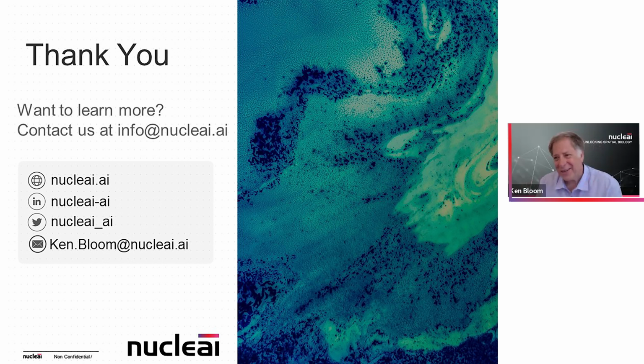It can classify every cell and understand the relationships between every one of those cells. So I could do it painstakingly, but I guarantee you no pathologist would. It would probably take me 10 hours and my eyeballs would fall out. Or I can use an augmentation tool that just does it. Now, I'd have to believe the augmentation tool. So again, it would have to be validated to the stain, the scanner, the algorithm, the whole thing. And I think that's the problem: you always have to think of these things as an entire test.